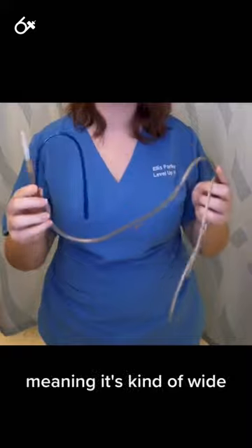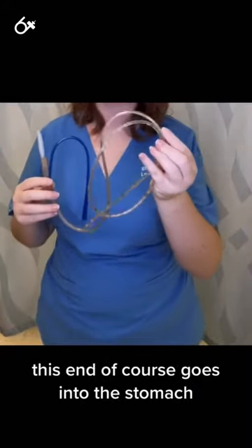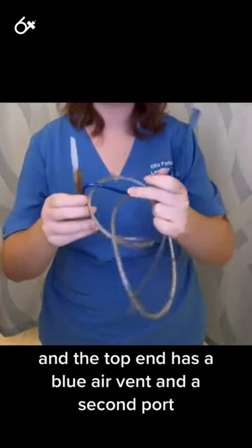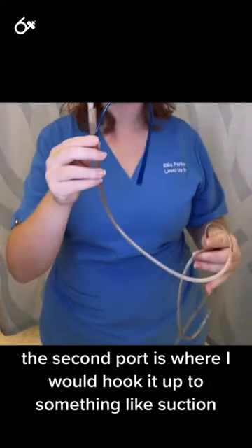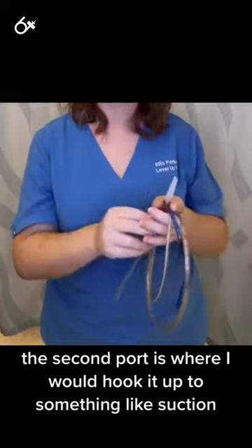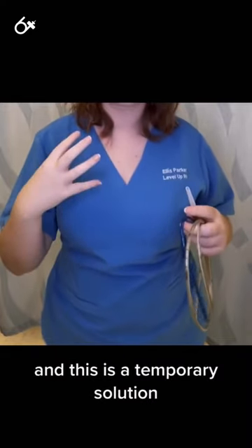It's a thicker bore, meaning it's kind of wide. This end goes into the stomach, and the top end has a blue air vent and a second port, so it's double-lumened. The second port is where you would hook it up to something like suction. This is a temporary solution.